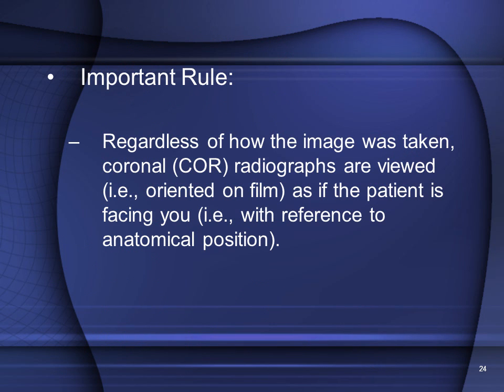This is really an important rule that you need to understand: regardless of how the image is taken, regardless of the projection, in a coronal or frontal image or slice (coronal is abbreviated COR), the image is viewed or oriented on the film as if the patient is facing you.